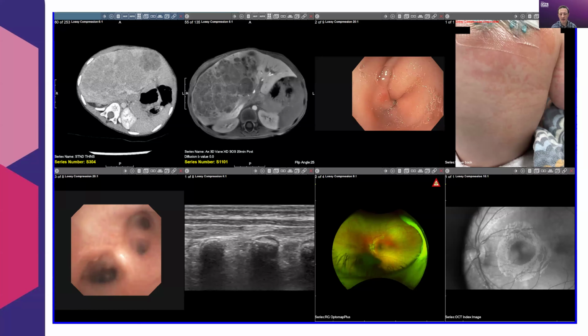Ophthalmology imaging can be sent, and pathology imaging deserves to be in this place as well. And so you could build these complex hanging protocols so that similar needs or similar patient conditions show up together, and we can compare them together. Having all of this imaging in one place allows us all to be better physicians, taking care of the patient in a more holistic way.